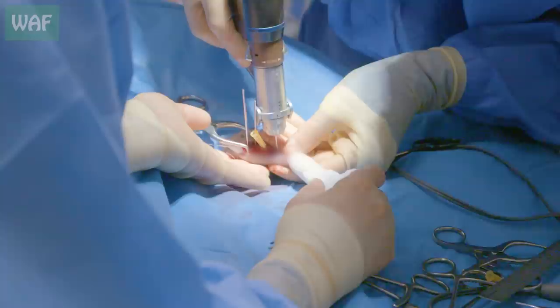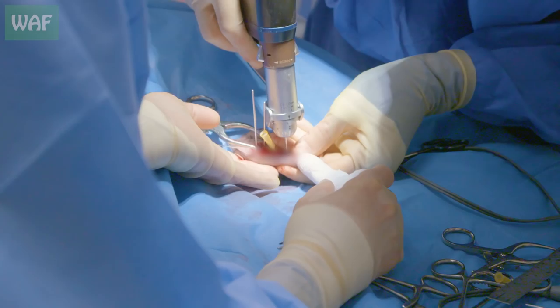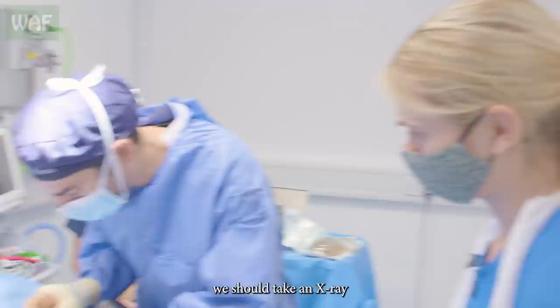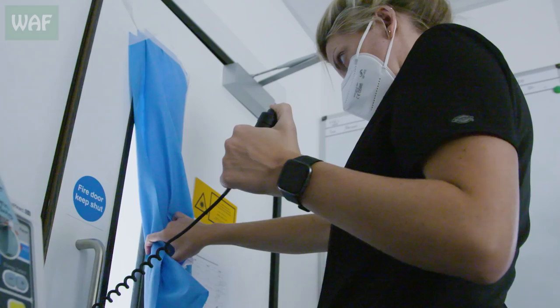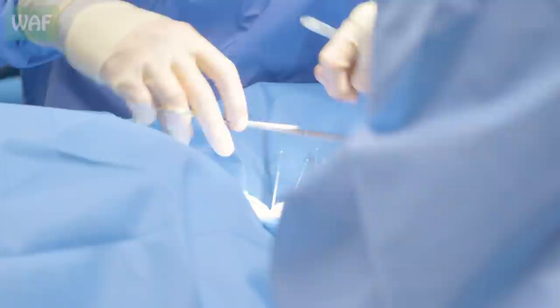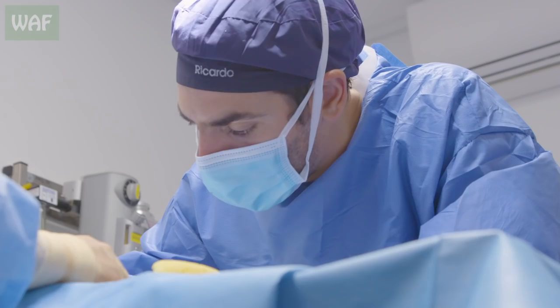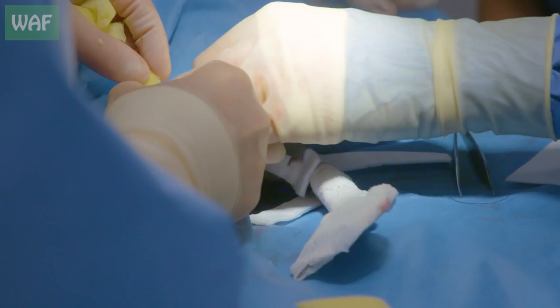Ricardo had to work quickly and carefully to ensure the pins were inserted correctly. With the bone already damaged, one slip could cause a catastrophic, irreparable split. We should take an x-ray to assess the alignment — hopefully we will not get any surprises. With the x-ray looking much more promising, all that was left to do is suture the wound closed and secure the frame in place. By folding the ends of the pins and encasing them in a special putty, the repair was held fast to allow the healing process to begin.